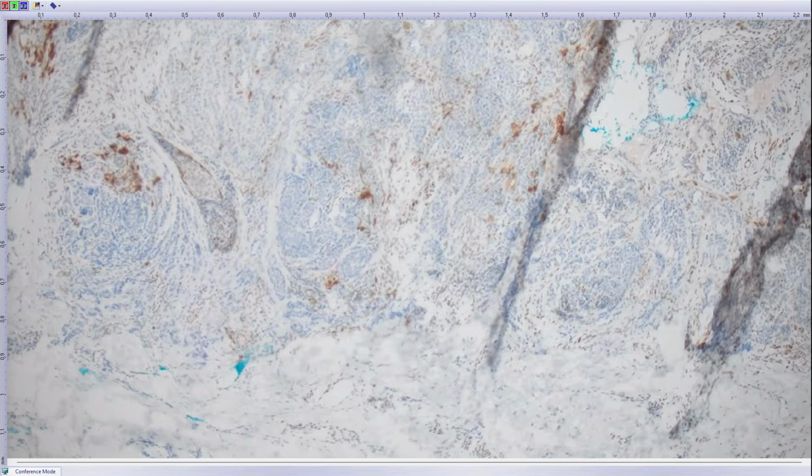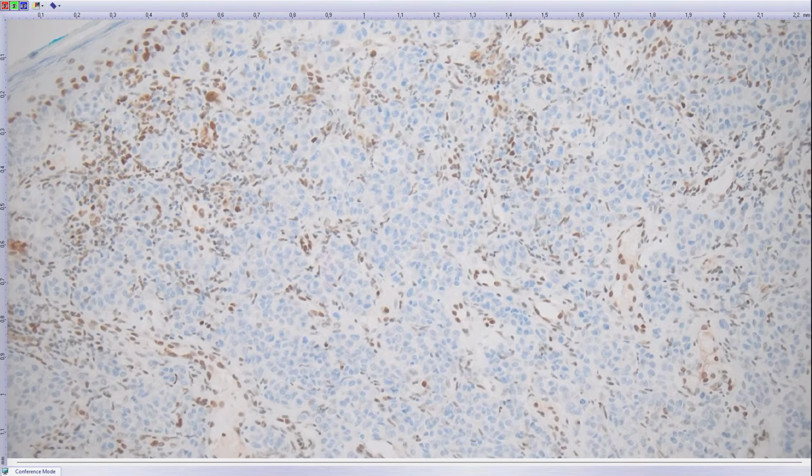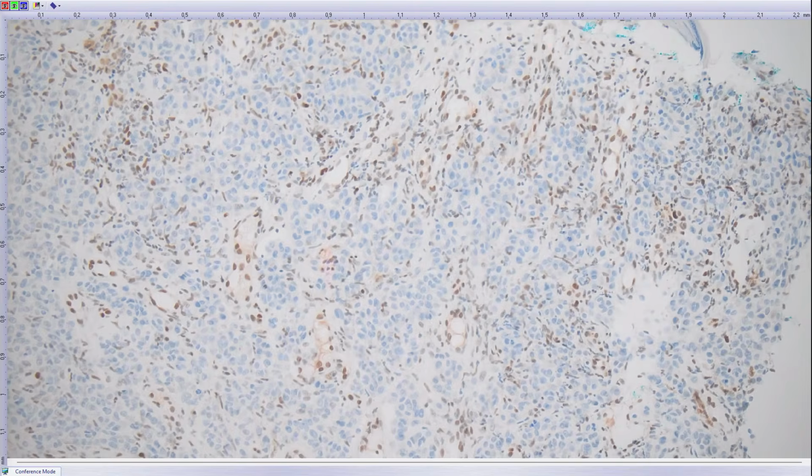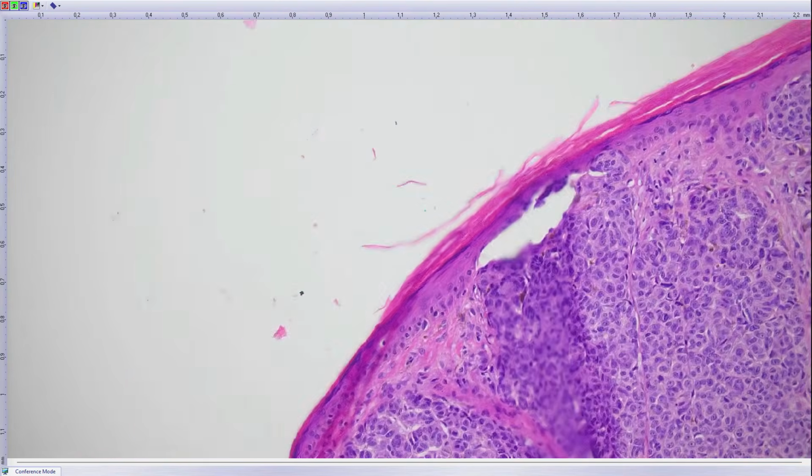These lesions, when you stain with retinoblastoma protein, are RB deficient, and this deficiency can be seen on genetic examination as well. RB1 deficient melanomas were never described in the literature, so we are not very sure what the malignancy is, but still we have already in our files from recent cases 3 lesions of RB1 deficient malignant melanoma.